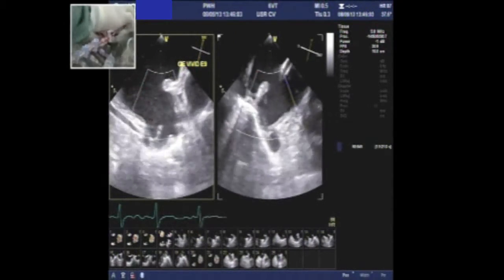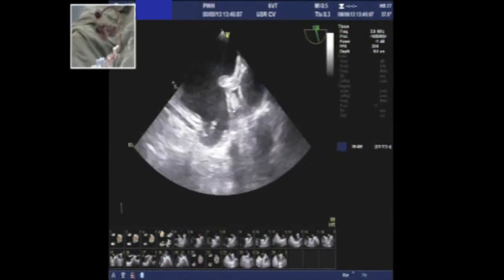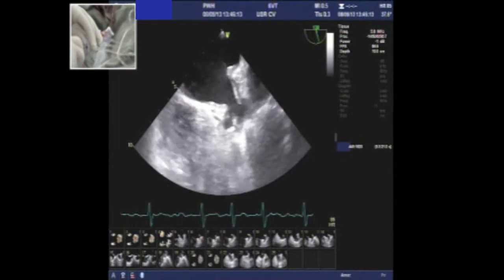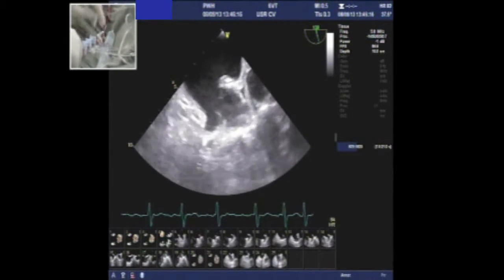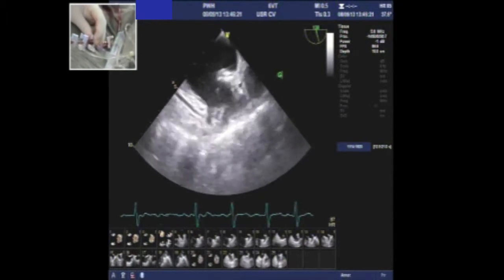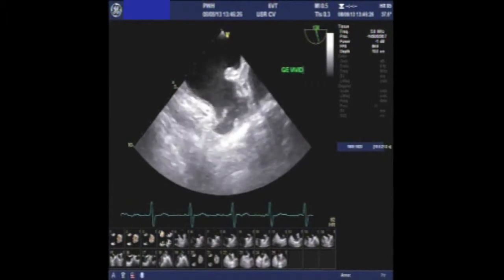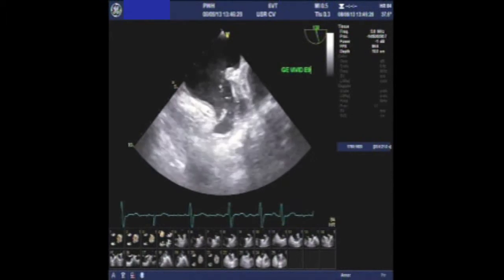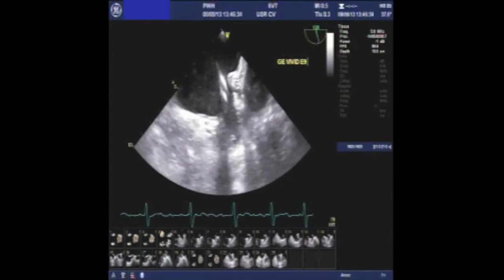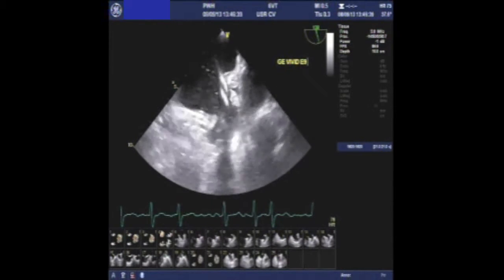Oh, there's a clang here. Okay. Where's it coming from? Okay, that's better. Good. So now we can do another angiogram, and I hope that I can see more of the distal end of the appendage. Yes, because it's a large sheath, so you need 3 times to fill it. Okay, good. And we are still in RAO caudal, that's good.